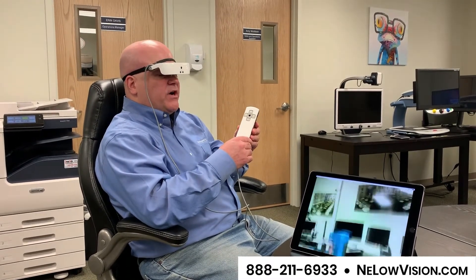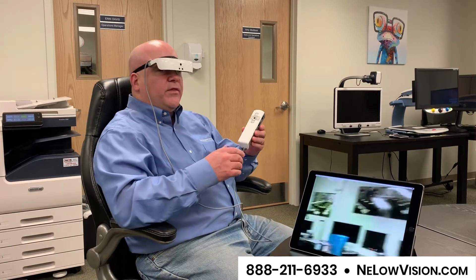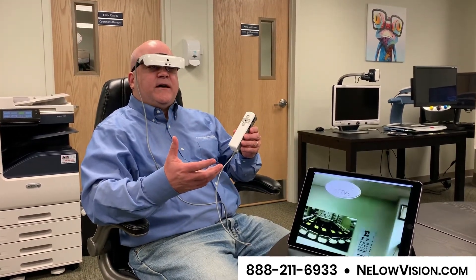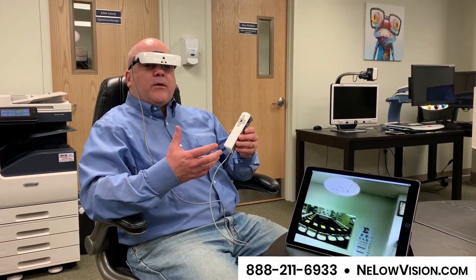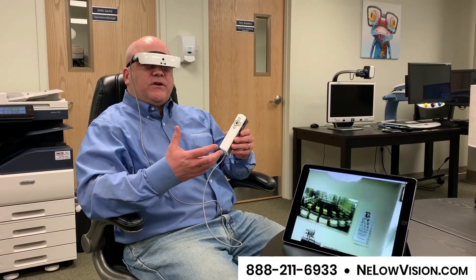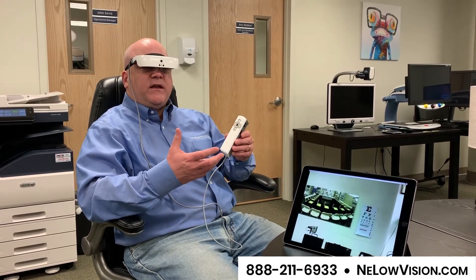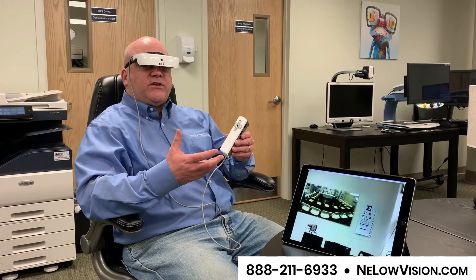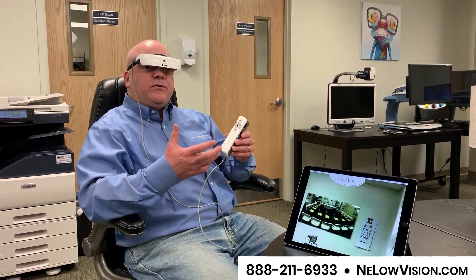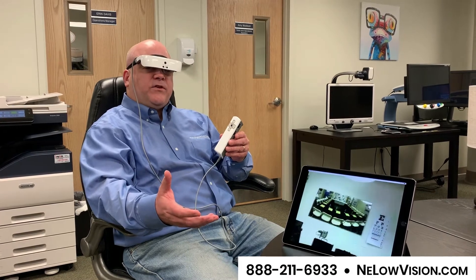This is something that you have to try. It's a wearable that we welcome you to come to New England Low Vision and Blindness and try on. Our appointments are really thorough and we want to make sure that you have a good showing of this device on your head. Bring your different materials that you want to read, and we'd be happy to show this to you at a time that's convenient for you if you just call the number at the bottom of your screen. Thank you.